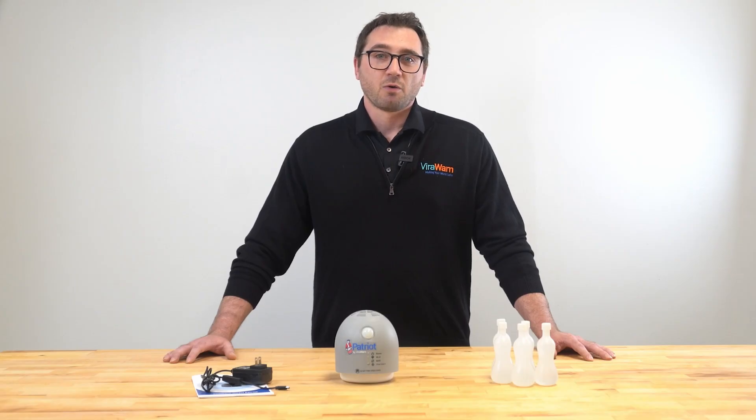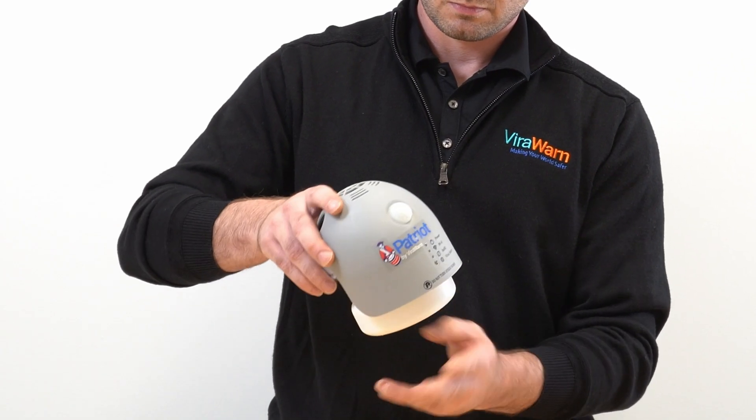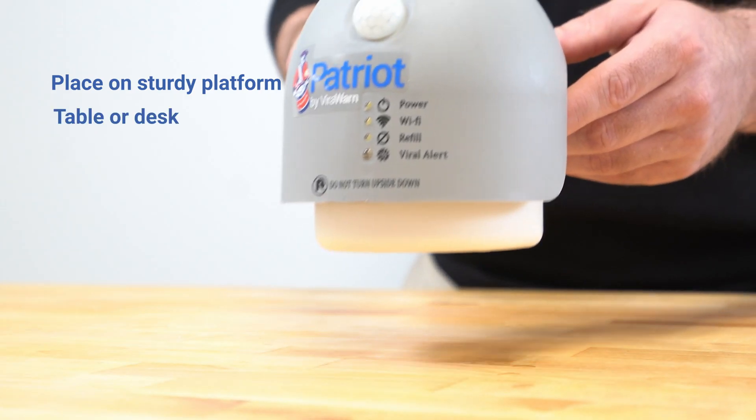First, take the Patriot by ViralWarn device and attach the detection chamber by rotating it in a clockwise direction. Then place the assembled unit on a sturdy platform, preferably a table or desk.